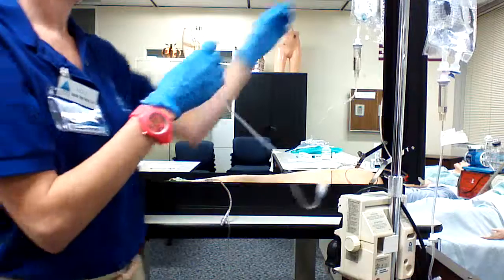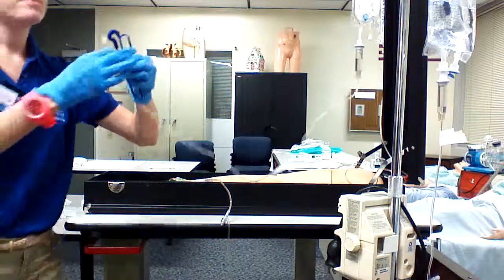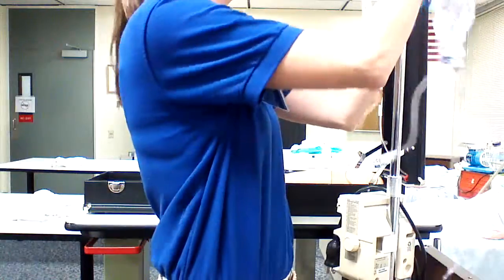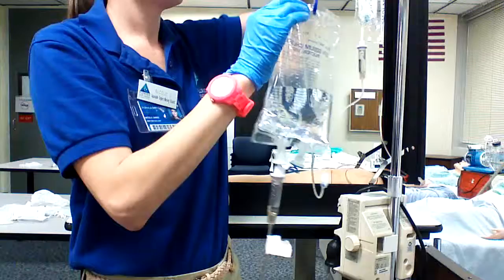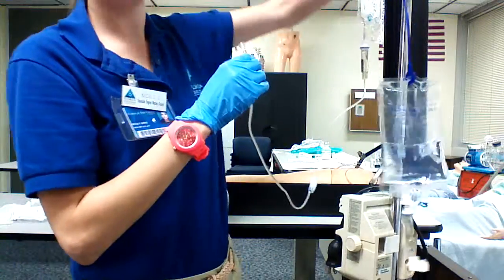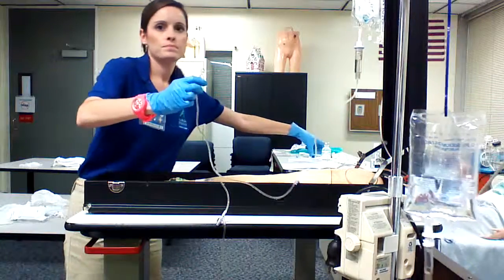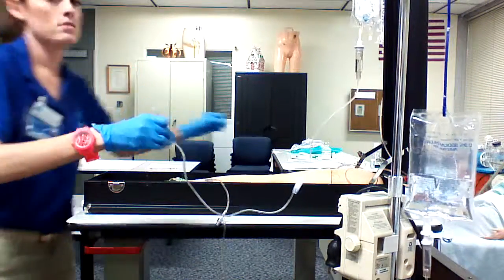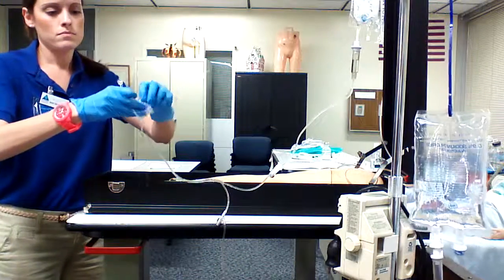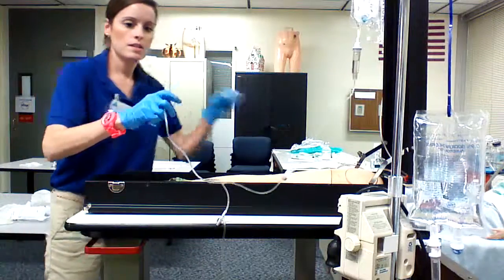Okay, so I'm going to hang that. And I'm going to lower my primary tubing so that it is lower than the piggyback medication administration. I'm going to clean my port with alcohol and connect the mini bag to the IV.